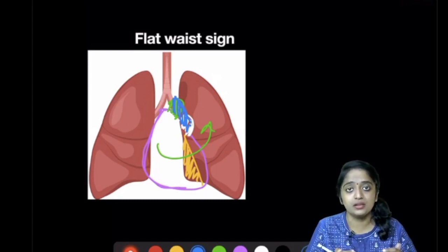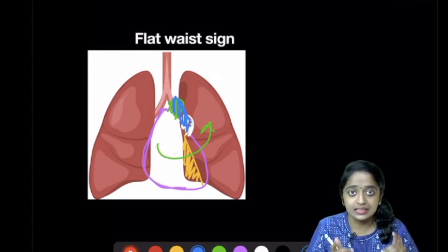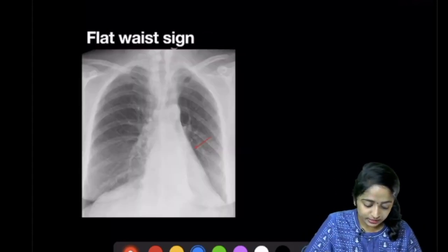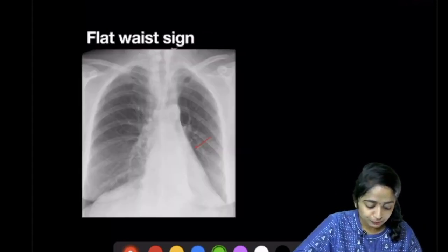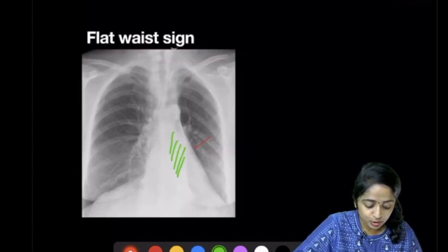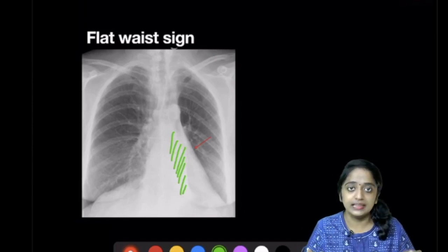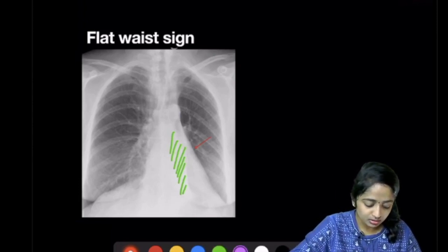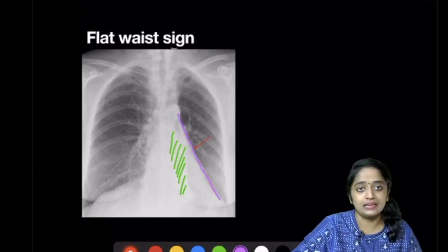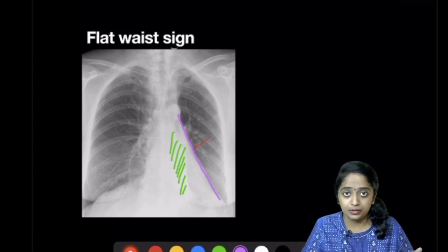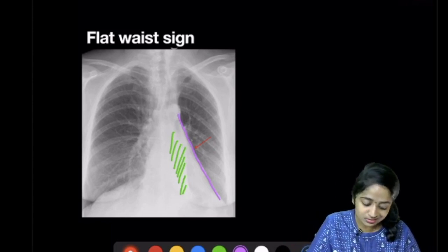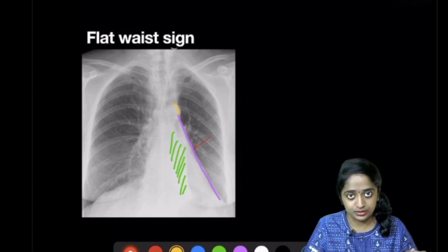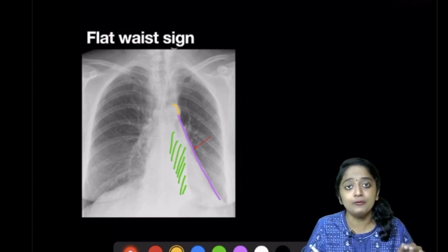As you can see in this example, there is left lower lobe collapse shown by a retrocardiac triangular density, and the left cardiac border appears flat. You cannot see the prominence of the pulmonary bay, and the aortic knuckle prominence is also obliterated. This is the flat waist sign, seen in left lower lobe collapse.